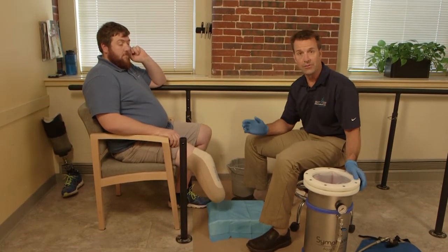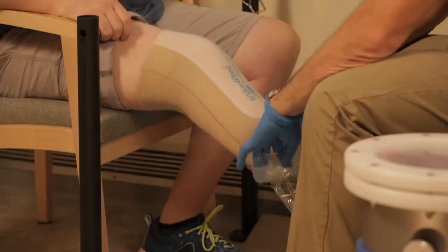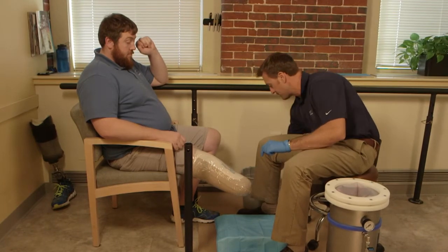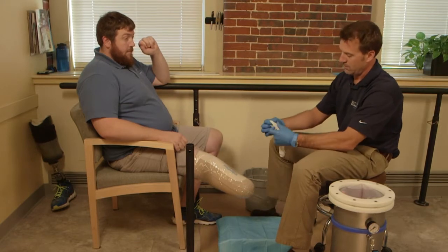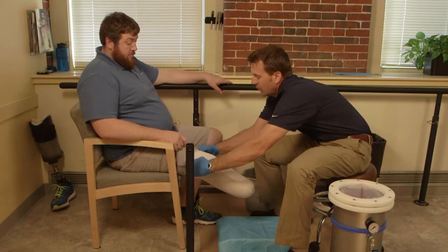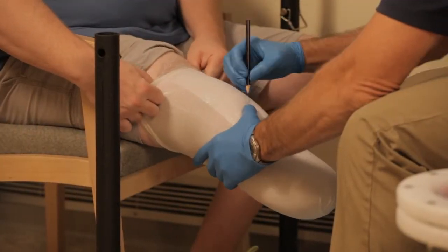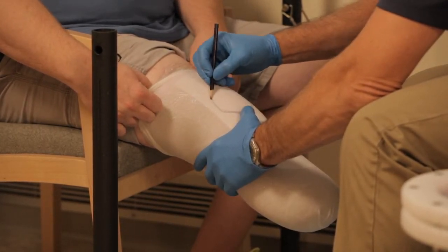So I'm going to go ahead and get started with the casting process. We do the first part of this like we would with any other scenario. I'm going to use a barrier bag over the limb. We're using a six millimeter gel liner. As I normally would, I'm going to start marking bony landmarks. When I have the finished cast, I will have these for reference.